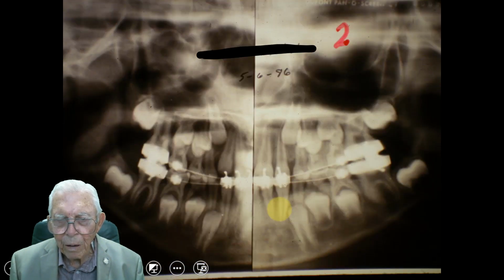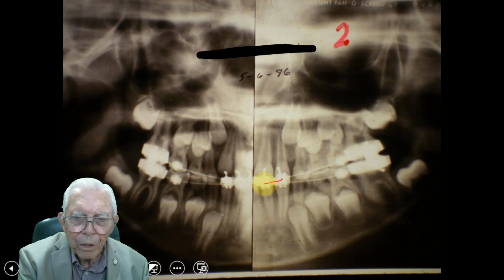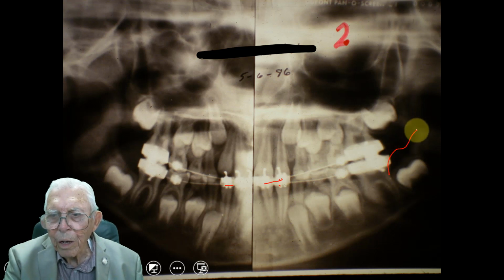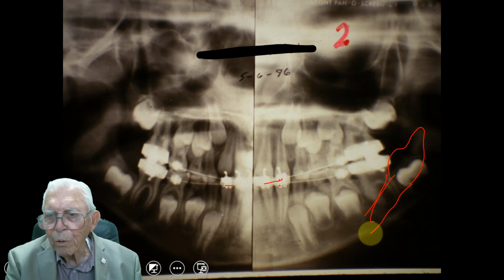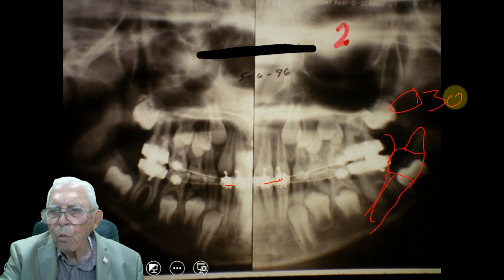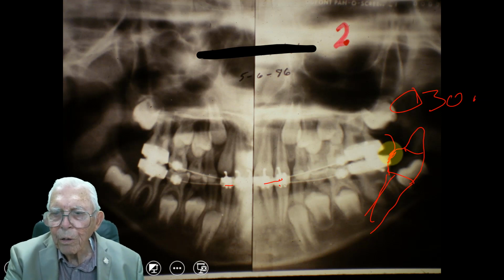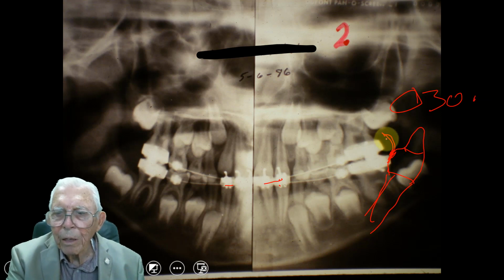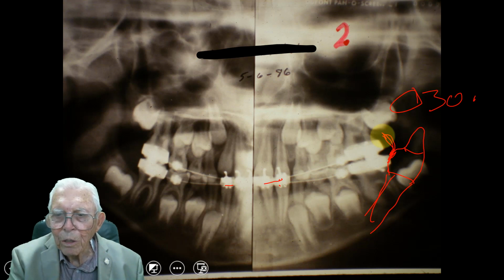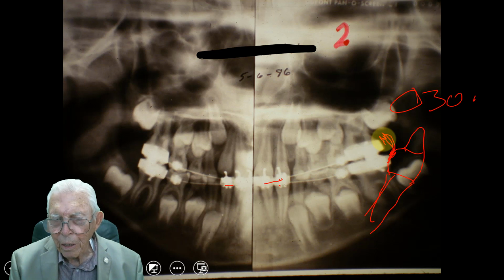So we are leveling the bite, but here we banded the 4 anterior teeth. You've got a tooth coming like this, with these roots down, and we put a band around that tooth, and we solder 030 wire to this right here, and then we bend this back so that it catches the tongue. They'll be coming up here and pushing the tongue out, and this will catch it right on the bottom of the tongue.